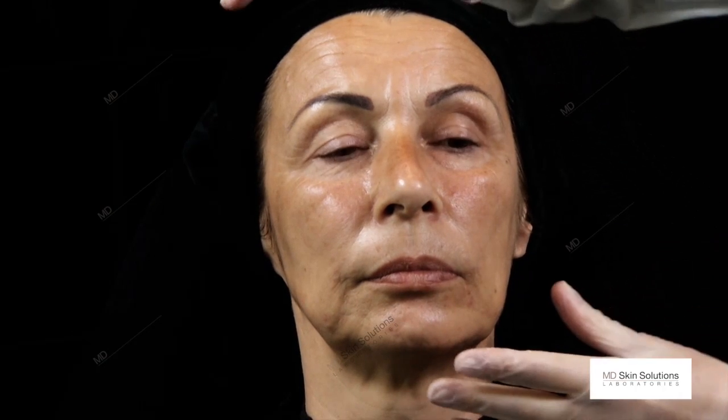Therefore, we will start to map the face and show the strategy of this injection. So I will mark the no-go zones and the go zones first.